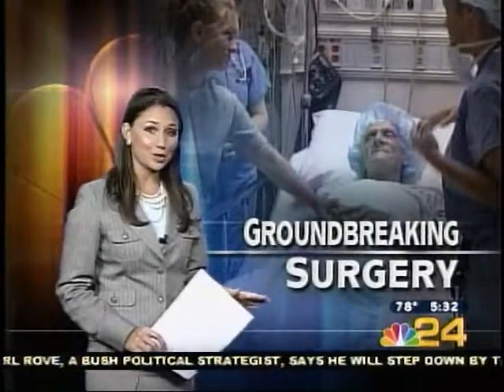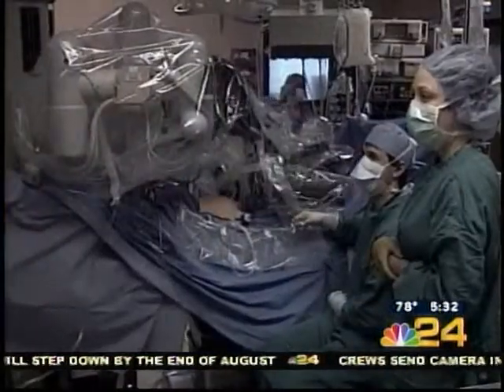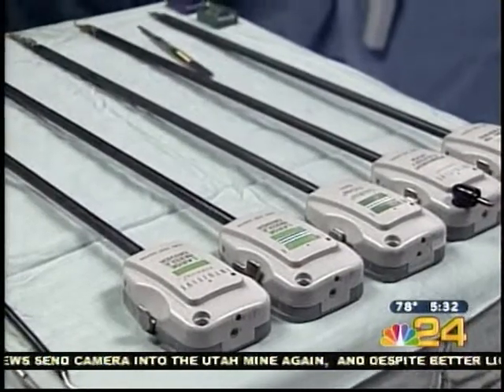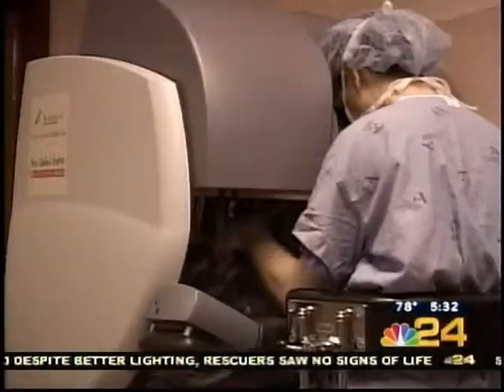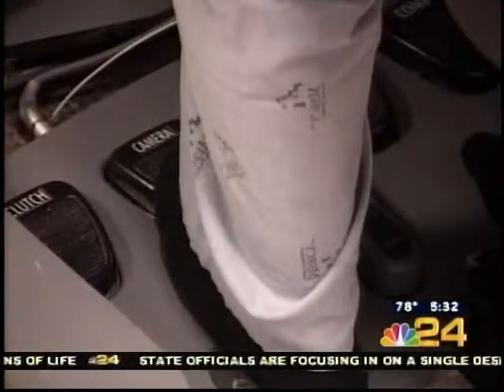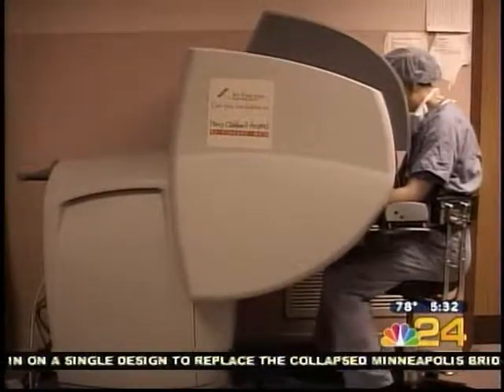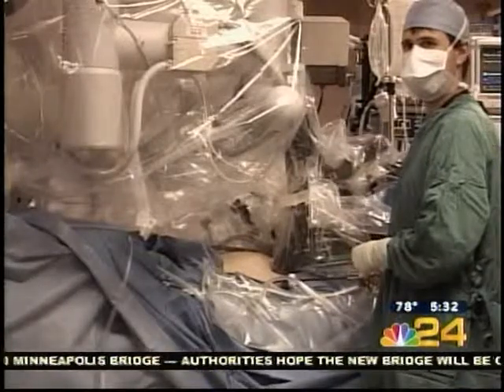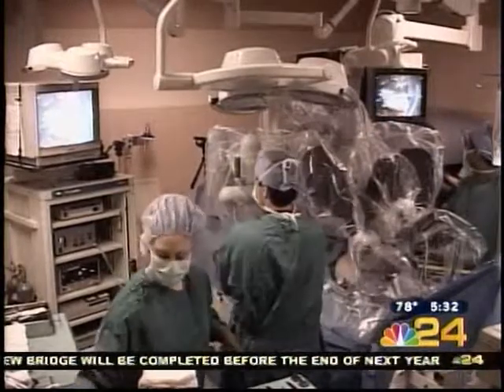Today was the second surgery, but the first look at this new method. The Da Vinci robot system cuts 4 tiny incisions, a 1/2 inch or less, to insert the robotic arms and the ports, and then 1 3-inch incision to remove the cancerous bladder. In an open surgery bladder cancer operation, a 1.5-foot incision is made. So this new technology allows for speedy recovery. Typically, the patient is on their feet within 24 hours and is back home within 3 to 5 days.